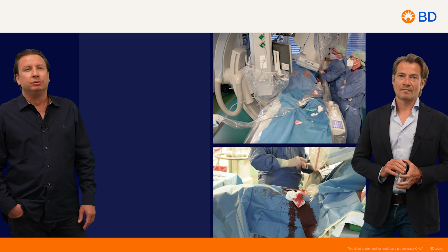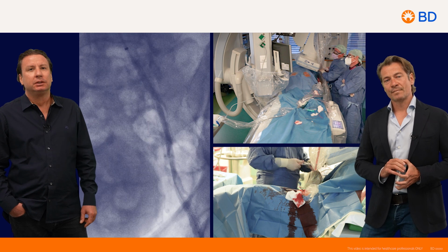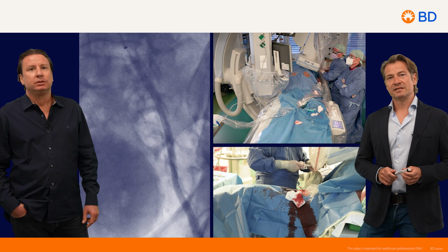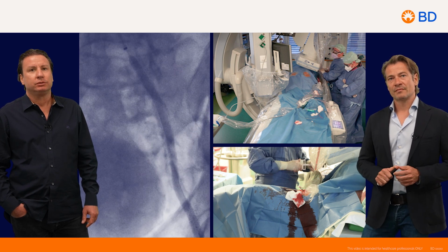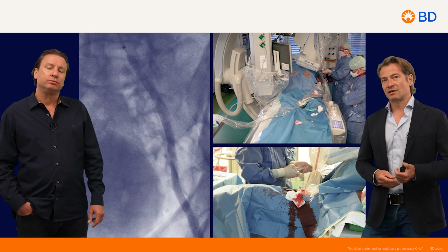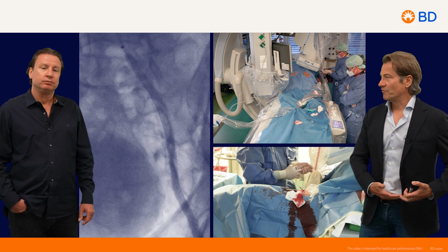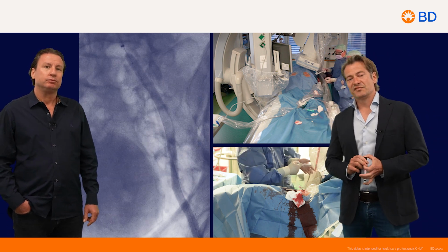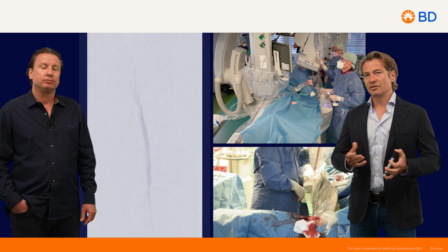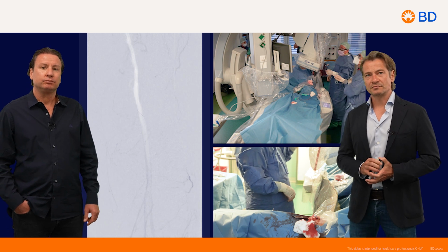And we use the balloon also in the external iliac, like demonstrated here. This is again a 6 millimeter balloon. Also with 6, you have to be careful in the iliac, and our patients are awake, so we can ask them if they have pain or feel something, which can be helpful to avoid perforations. And then we increase the pressure and also the size of the balloons.